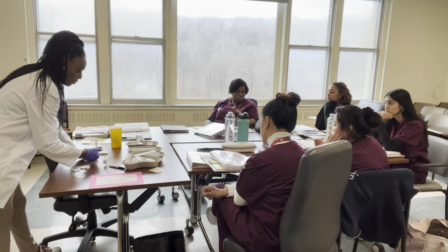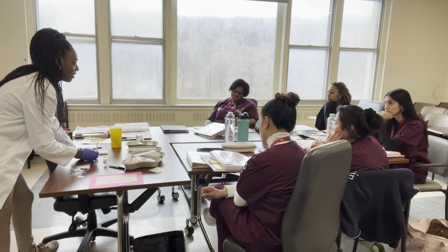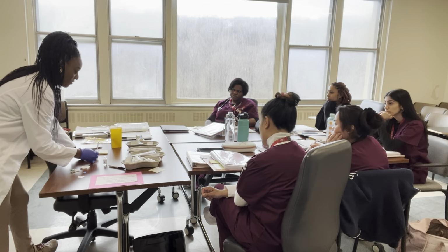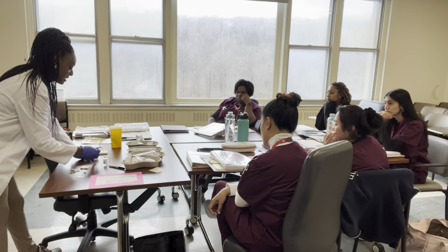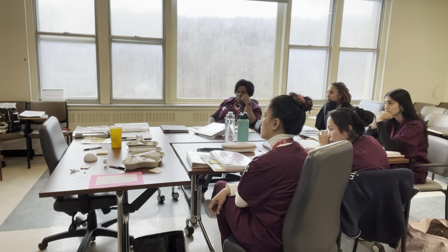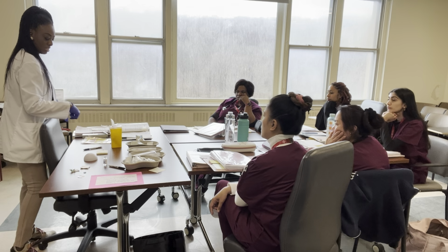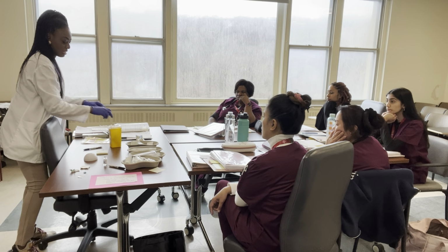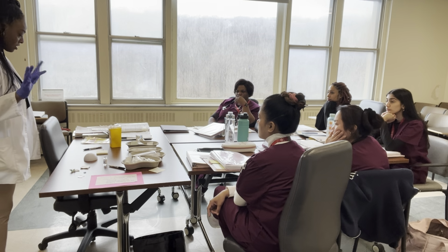One second, I have a needle in my hand, sorry. Then when I'm taking it out, how long do I wait? 5 seconds? 5 Mississippi. I take it out, and then what do I do? Put it into the sharps container directly. Because of the label, I can't get it all in, but into the sharps container. Do anything with the patient? No, I just leave them there with blood?